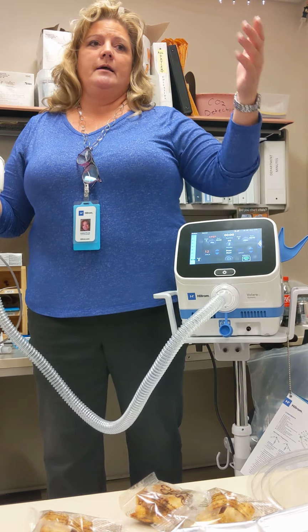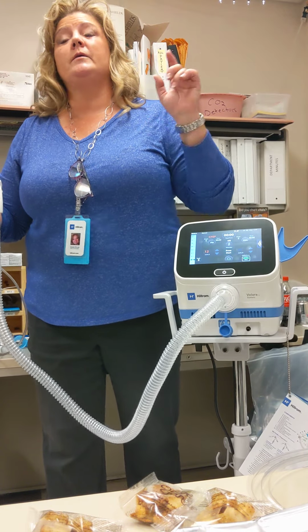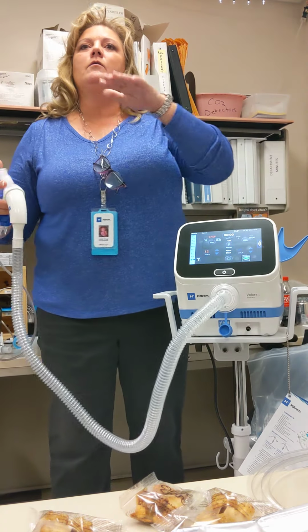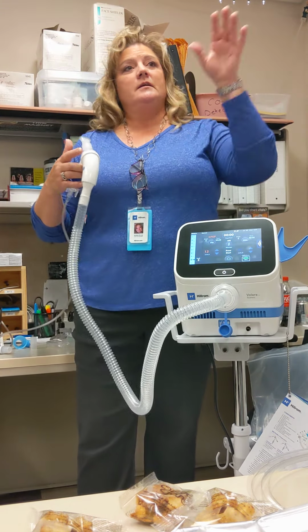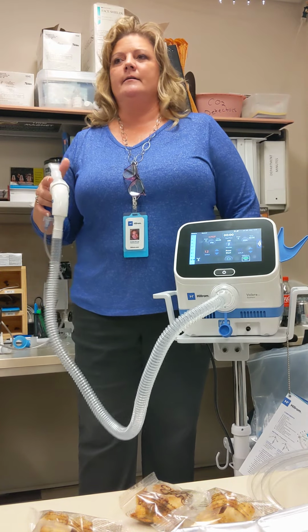Sometimes. I had a patient at the University of Minnesota. To get good chest wiggle, we went up to 49. Now, as he got healthier, we didn't keep it at 49, we brought it back down, but still maintained the chest wiggle. Once he got off the vent, he was doing it spontaneously, and he was usually riding around 29, 30, 31.